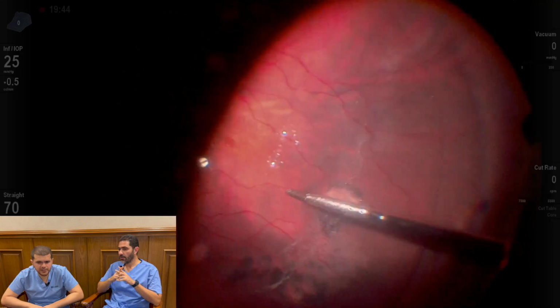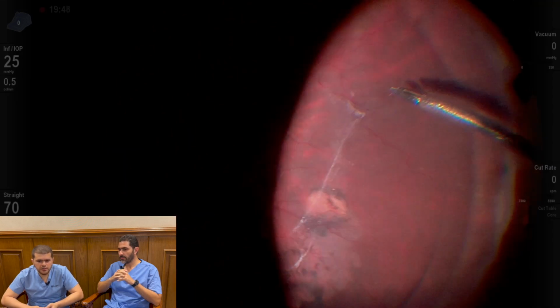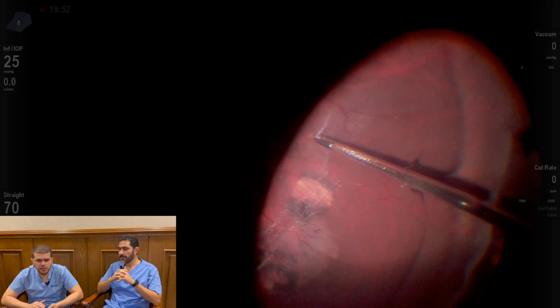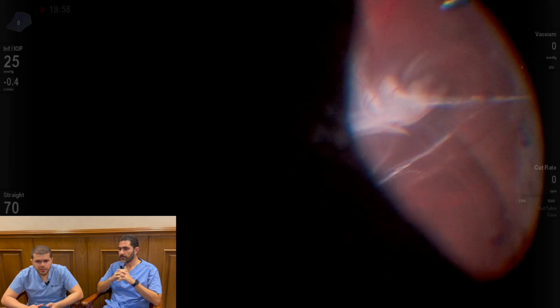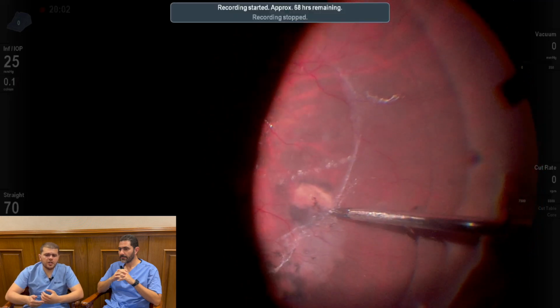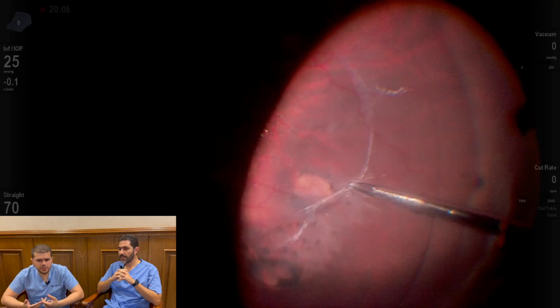Yes, that's exactly my thought process. I decided not to leave this hyaloid, and to try as much as possible to peel it and to remove it, even if I cause iatrogenic tears. So here I'm pulling with more and more force, but I realized that as time goes by, there is more hydration to the vitreous and things come easier.